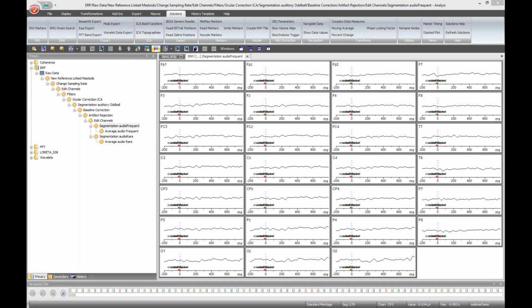So for example, if you wanted to do ICA to clean your data before, then we always recommend having more channels, and 32 is actually quite hard to answer regarding ICA. It also goes into a different topic a bit, but basically ICA needs as much data as possible, so more channels are better. Depending on what kind of components you want to reject, 32 might just be enough. But otherwise, regarding coherence, you can also just have 2 channels and calculate it between those.